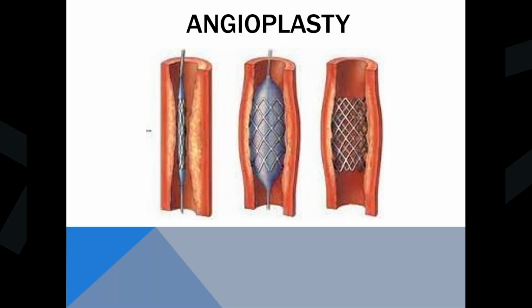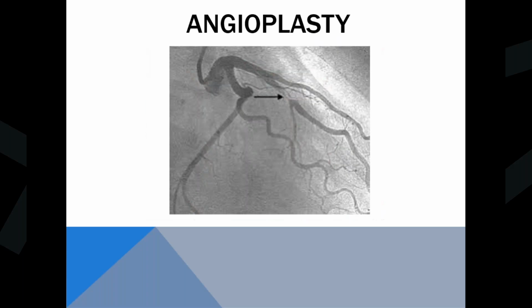Then they will deploy the stent, and the stent will grow inside the walls of the coronary artery and keep it open so it's not causing the obstruction that was on the previous image. And that's from too many cheeseburgers, too much pizza, smoking, all those bad things that we do that we're told not to, and find out later that that wasn't a good thing.